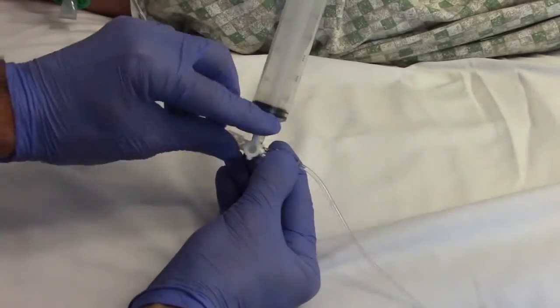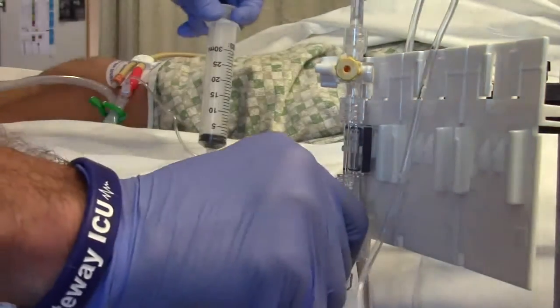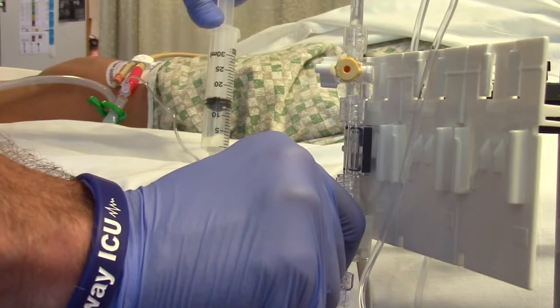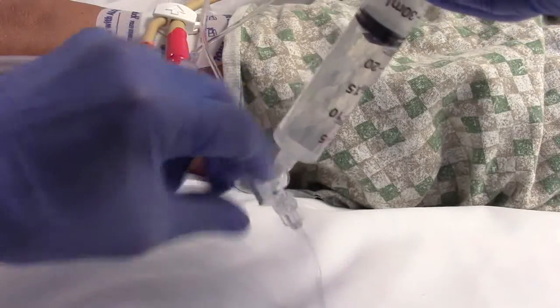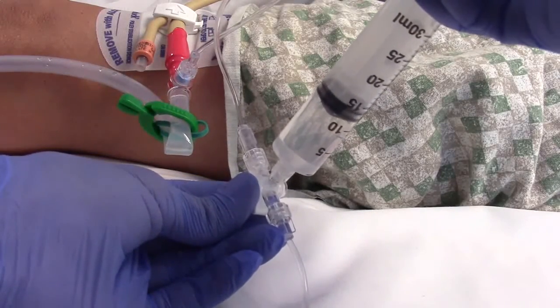Turn the transducer tubing's distal stopcock off to the patient, and while activating the squeeze flush, pull back the syringe plunger and fill to a maximum of 25 milliliters. Then turn the stopcock off to the normal saline and inject the 25 milliliters of normal saline into the bladder.